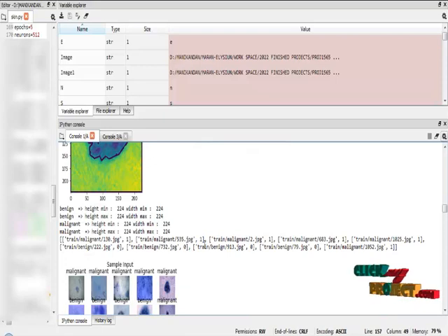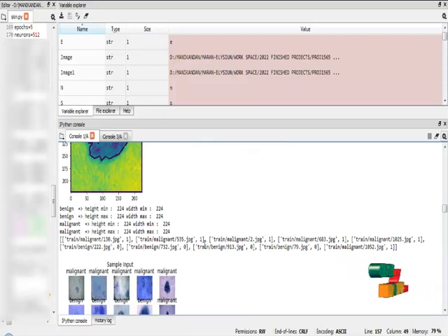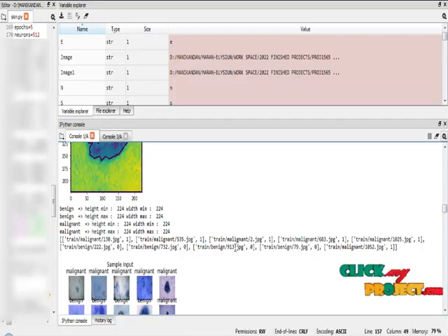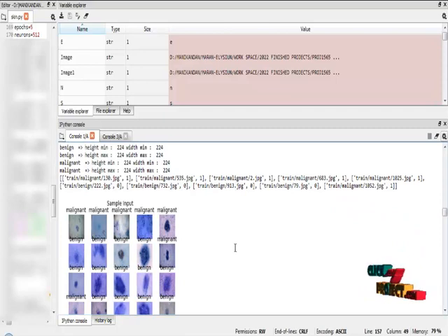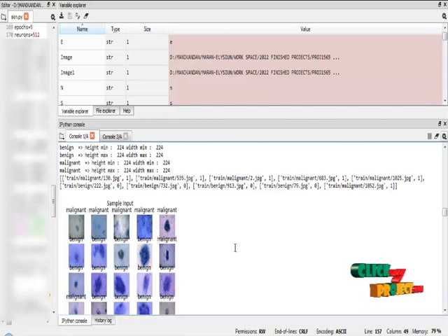In contour detection method, it will draw the contour of the cancer region from the input images. After that, I have to check the minimum height and minimum width, maximum height and maximum width for benign and malignant classes. I am going to provide the label for the benign and malignant classes like zeros and ones.